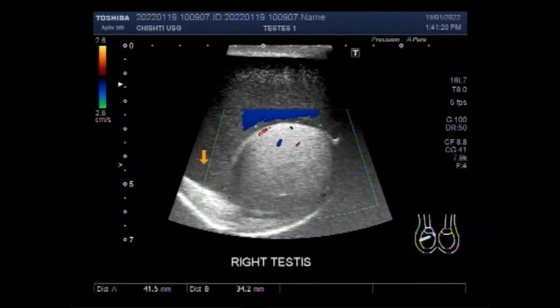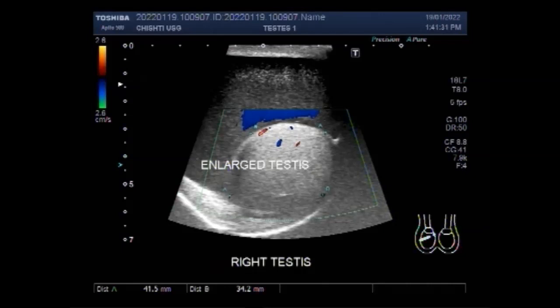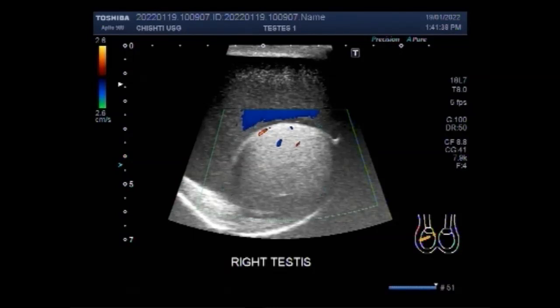You can see that the testis is slightly enlarged in size, and a large amount of fluid is seen all around this testicle due to pyocele.